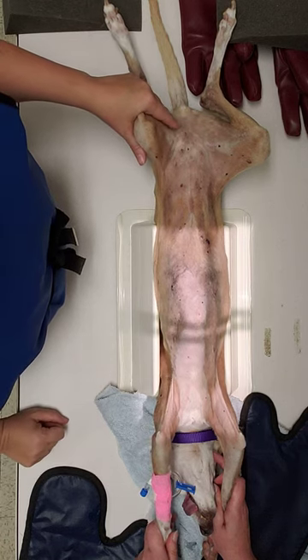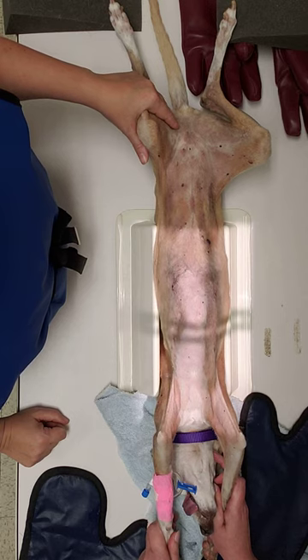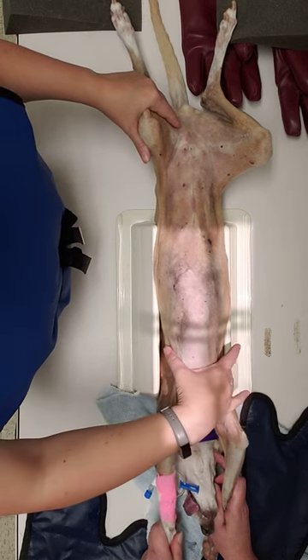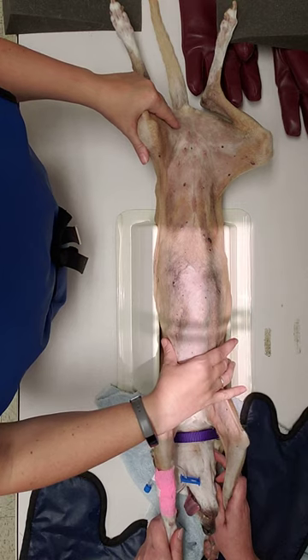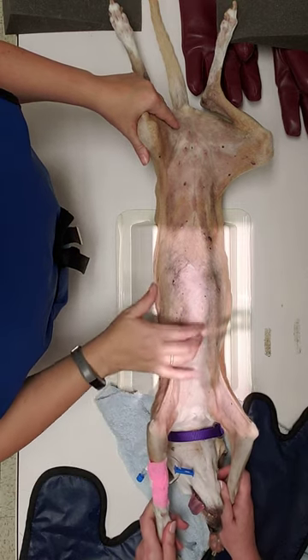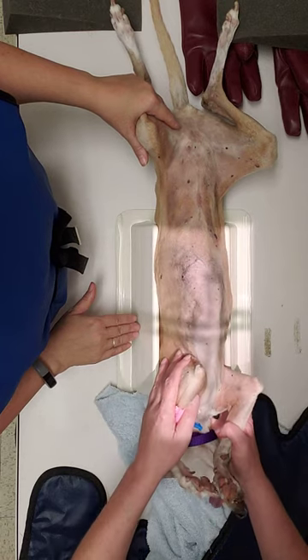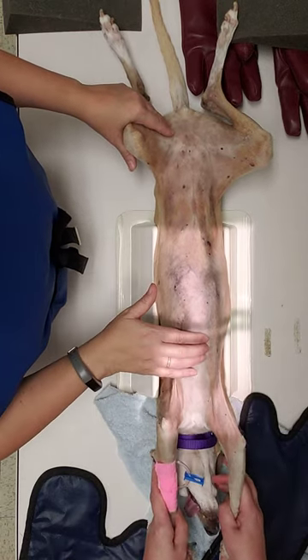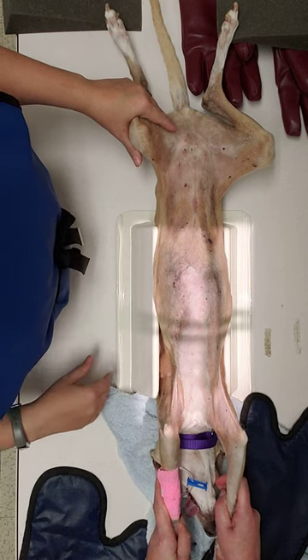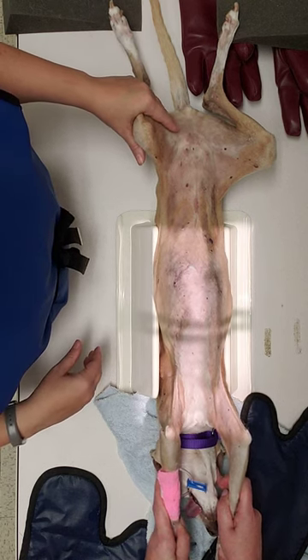For VD thorax, you're going to make sure you put your patient in dorsal recumbency so they're on their back. You're going to use your V tray. Positioning is of the utmost importance because you need to make sure your sternum stays above your spine. Any kind of crookedness not only shifts that but shifts the position of the heart and it will become considered non-diagnostic.